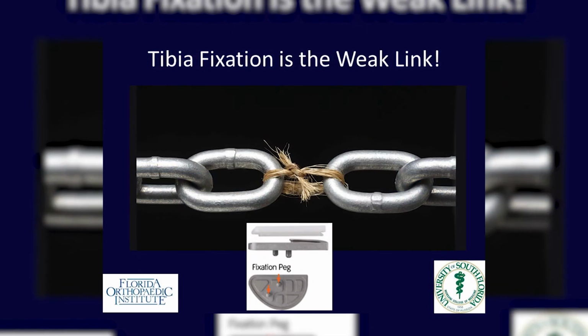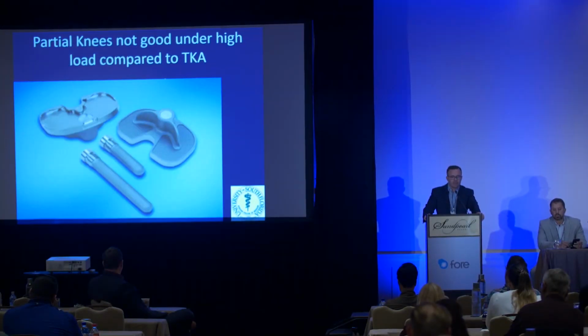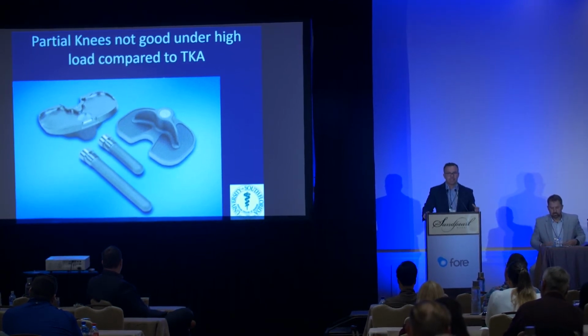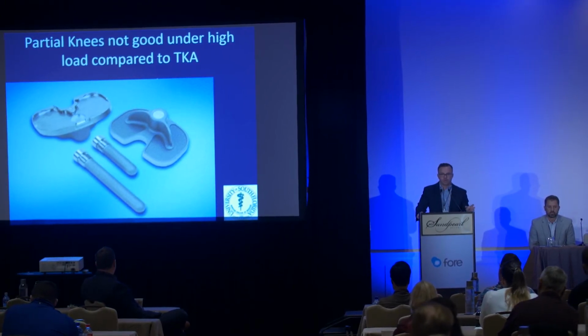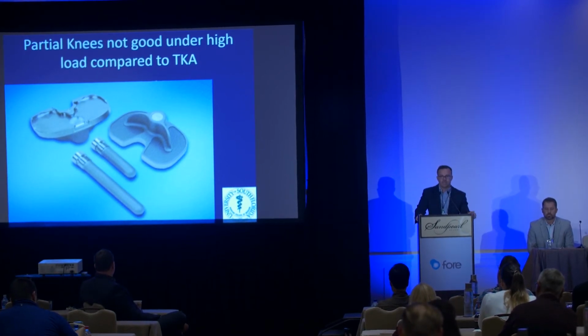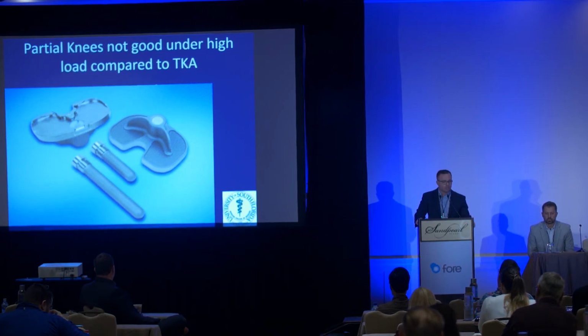When you evaluate a lot of these indications, I think you'll find that they really are pointing towards not overstressing the implants. These implants are not as robust as total knee arthroplasty components. Specifically, the tibia. This is the weak link of the surgery. When you look at a total knee arthroplasty tibia, for instance, you'll note that there's a large surface area for fixation. It's covering the entire tibia. You generally have large keels, sometimes even stems. You can modify the implant to have stems to improve fixation in the large patient.